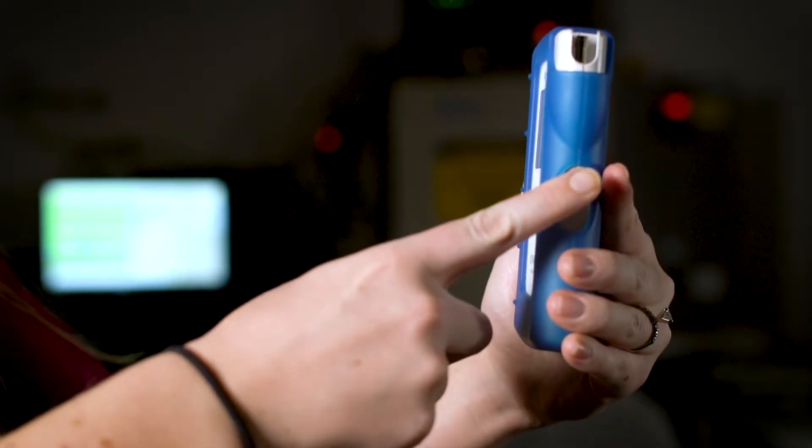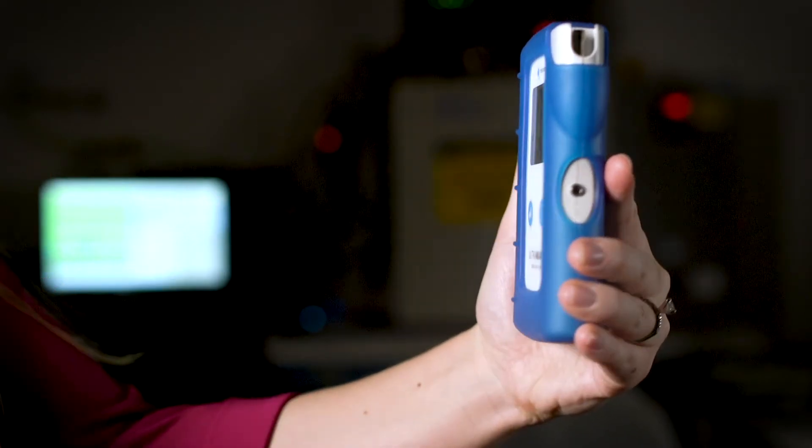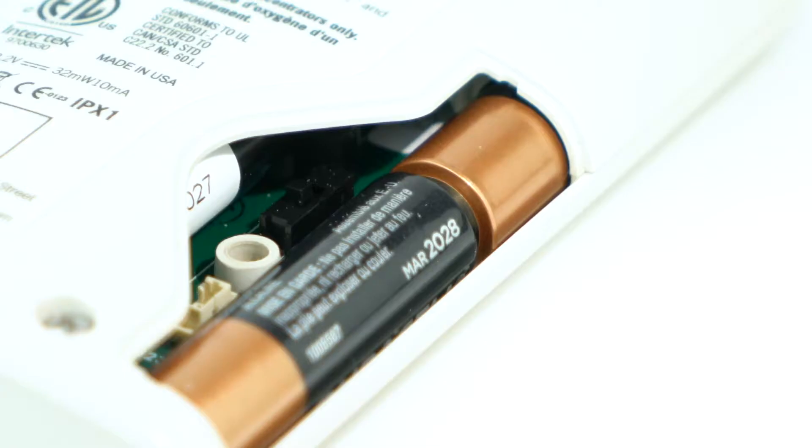To check the pressure, simply apply pressure to the gas sample outlet with your finger, and the screen will switch to display outlet pressure. The pressure can be measured in both pounds per square inch and kilopascals. There's a switch inside the battery door to change the unit view between PSI and KPA.